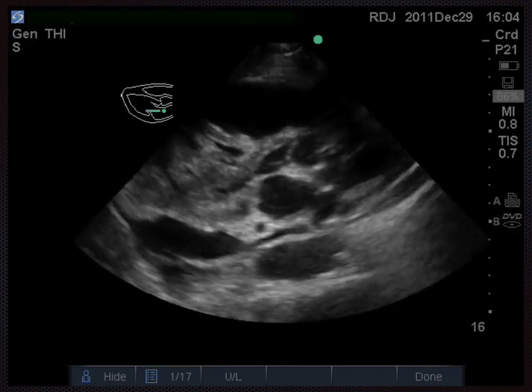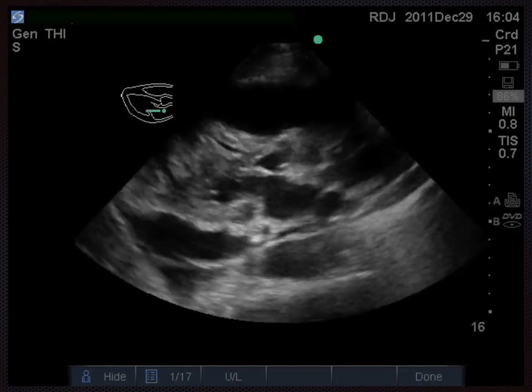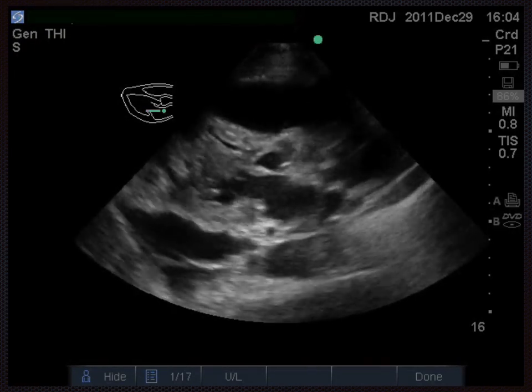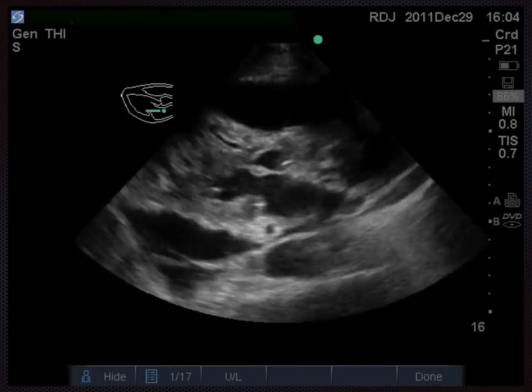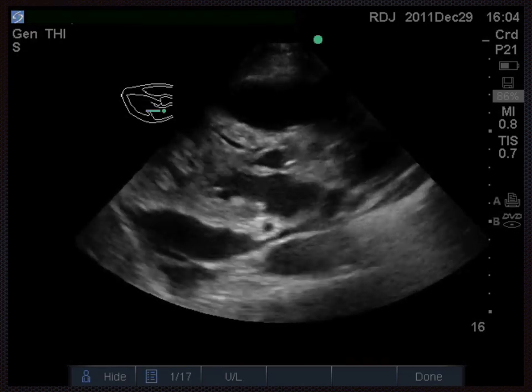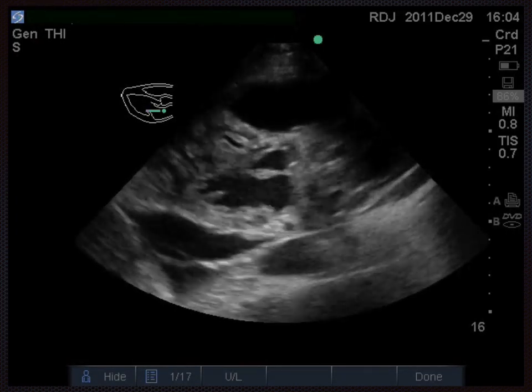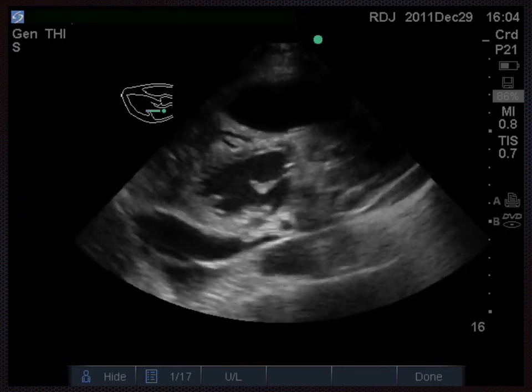Also, is it radially contracting? So it looks like the walls, as we said earlier, are almost touching themselves at the end of systole. So there does seem to be radial contraction by more than 30%. So although we've commented on small chamber sizes in D, certainly the effort looks like there is reasonable effort to the left ventricle seen on this view. We wouldn't be able to comment on the right ventricle function on this view.